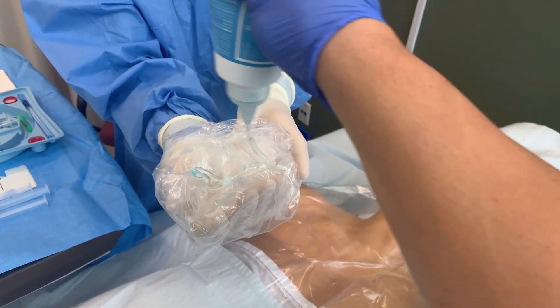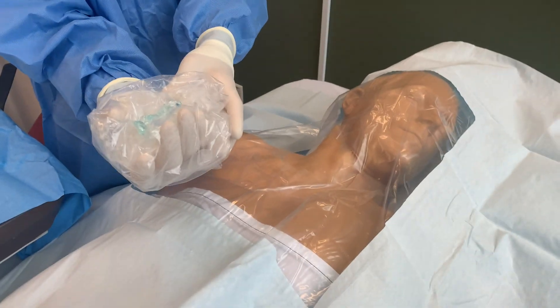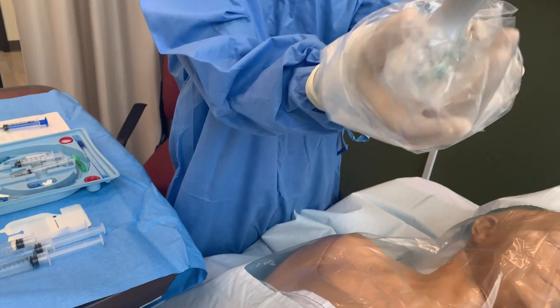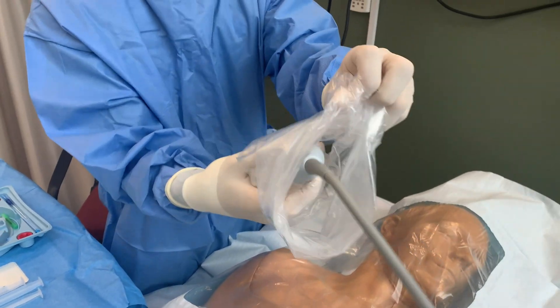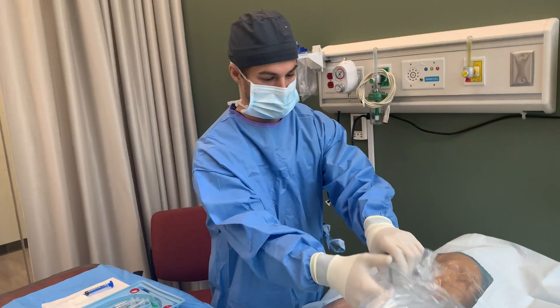Next, place sterile gel into the ultrasound drape. Have an additional staff member drop the probe into the drape while you advance the cover over the probe and cord. Secure the head of the ultrasound probe with the provided tape or rubber bands and secure to the sterile field.